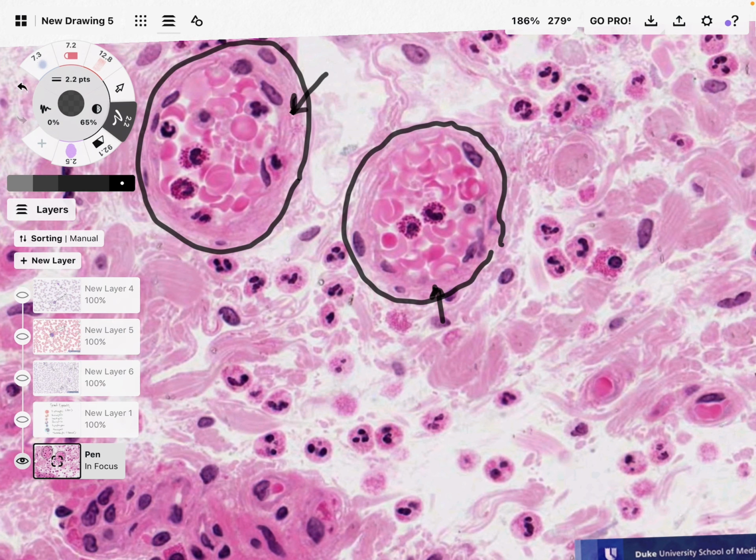And you can also see something else that I think is important that I will definitely talk about at some point. But these really flattish looking cells close to the lumen or the inside of this blood vessel. All right, I'll get to those here in a second. But how do I know this is a blood vessel? Well, as you know, red blood cells have this biconcave shape. They have no nucleus, so therefore they only stain with the eosin.